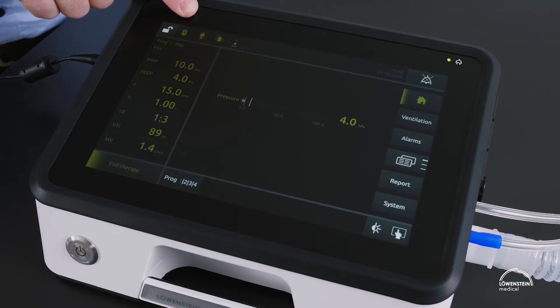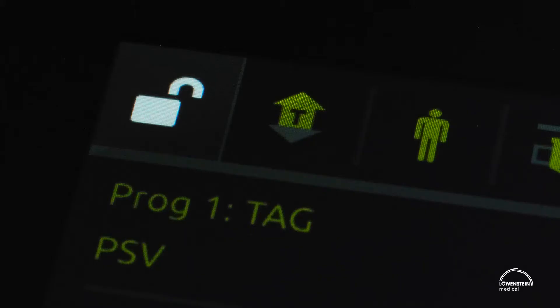Next to the lock symbol is the phase — the breathing phase indicator: up for inspiration, down for expiration, and SRT for spontaneous and timed are displayed.